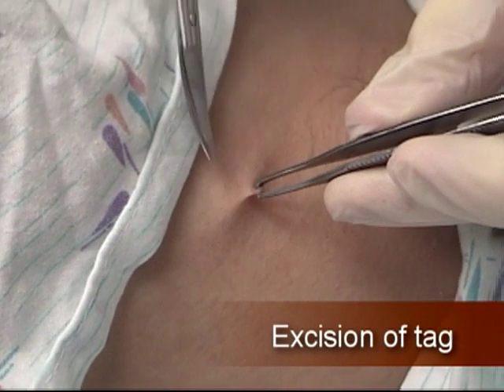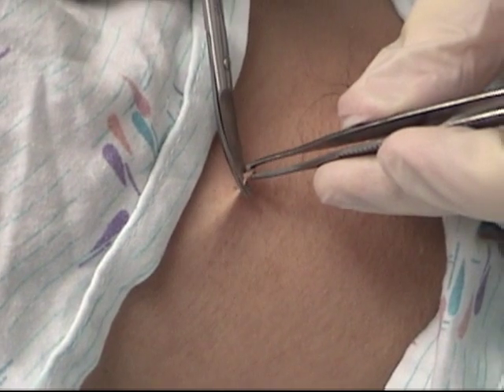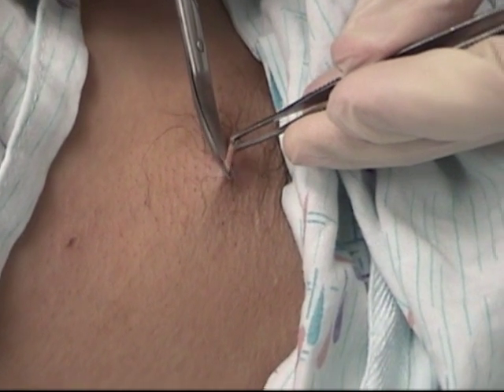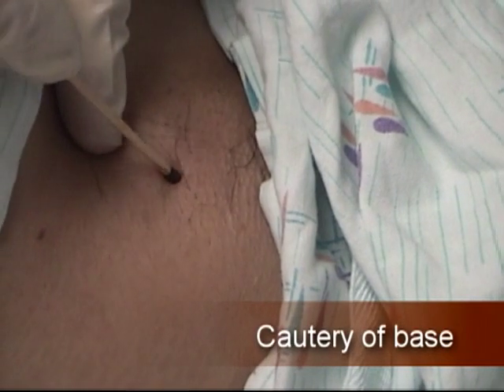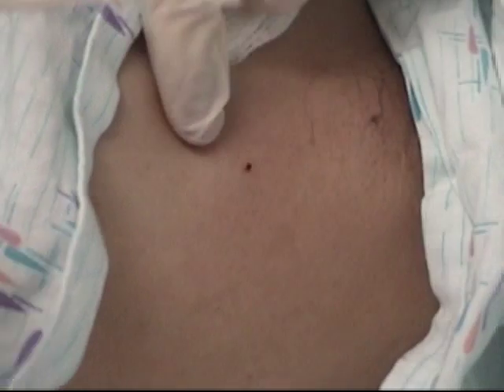Grasp the skin tag with a forceps and trim it at the base with iris scissors. Cauterize the base of the skin tag with either electrical or chemical cautery methods.